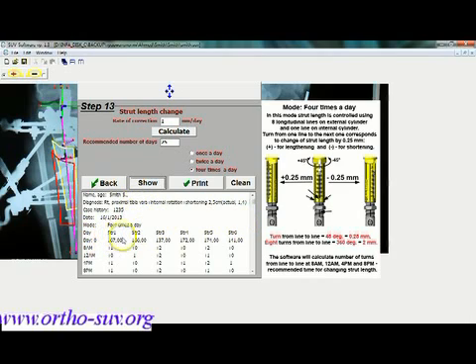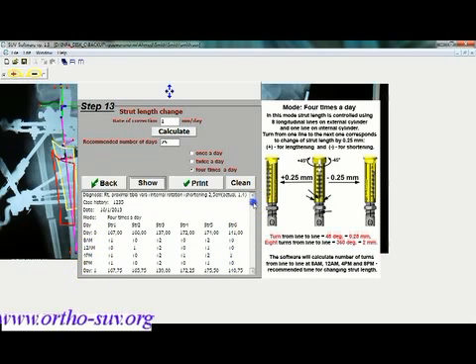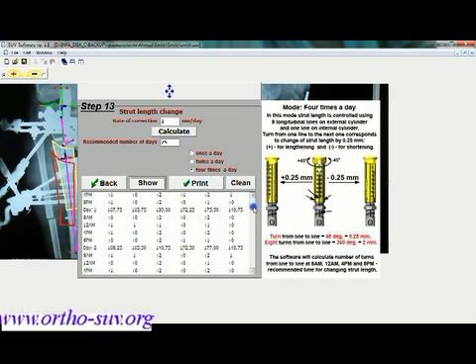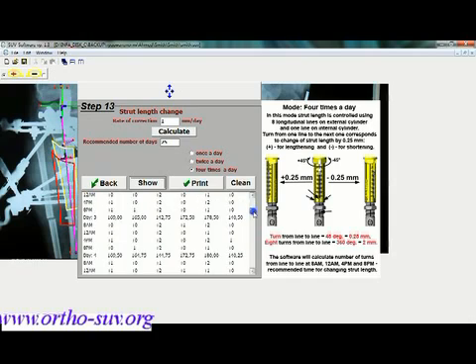You click the show button and you see the schedule of strut length change. In this case, it will be four times a day strut length change. The strut will have to be changed at 8 a.m., 12 p.m., 4 p.m., and 8 p.m.